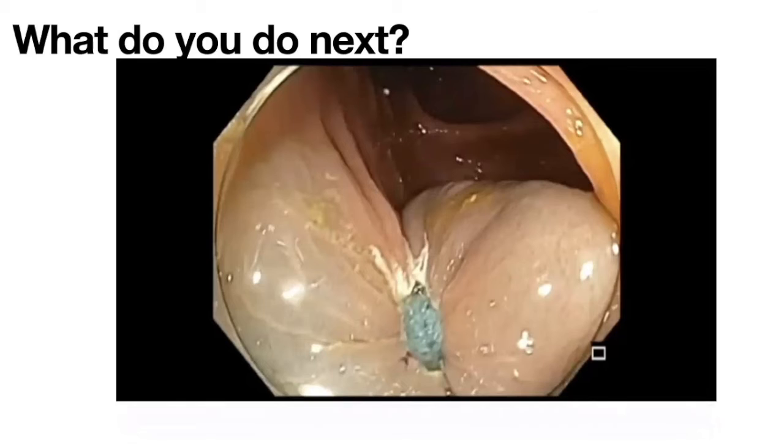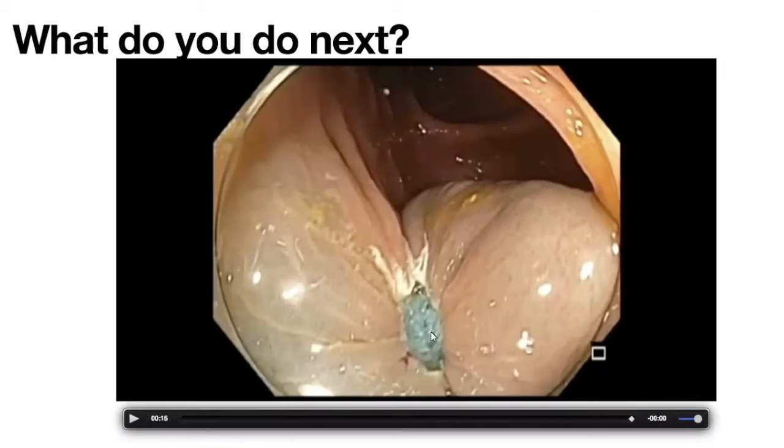So yes, for the sake of fellows, when you do the resection, you want to look for at least 2 things. When you look at the base and you see nice blue, meshy submucosal connective tissue, you know that the depth of your resection is limited to submucosa. It's not gone beyond the submucosa to involve the muscle. And if you remember the excellent work done by Michael Burke, published in Gut, looking at the depth of the resection and the risk of delayed perforation, when you see submucosa like this, you could tell your patient that you are not at risk for perforation.